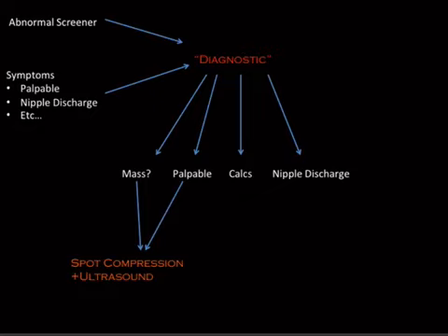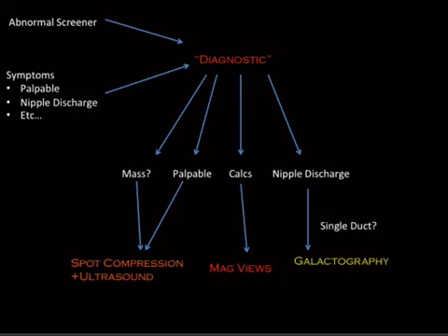Calcifications, those are the ones that are going to get mag views. That's different than a spot compression. So mag views for calcs, and that's to characterize them. And then nipple discharge, depending on its characteristics, will end up getting galactography, unfortunately.